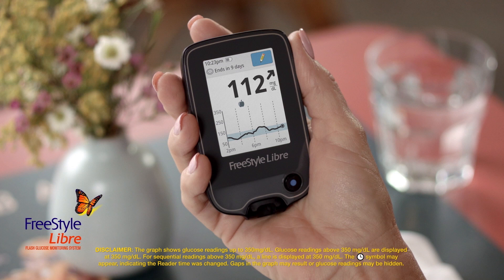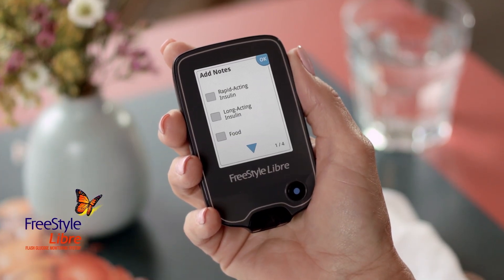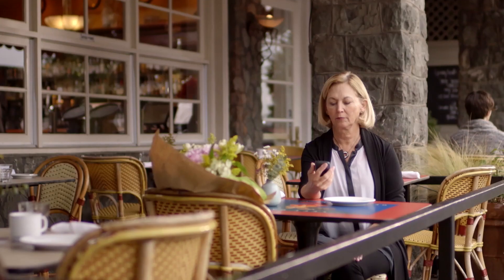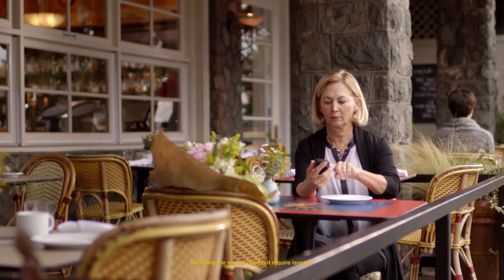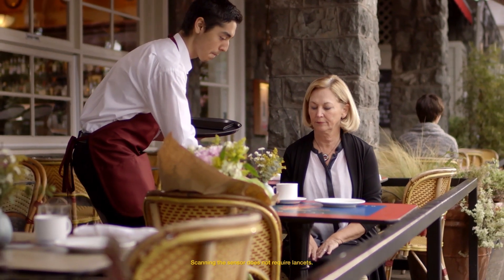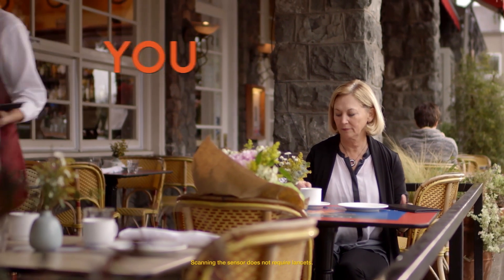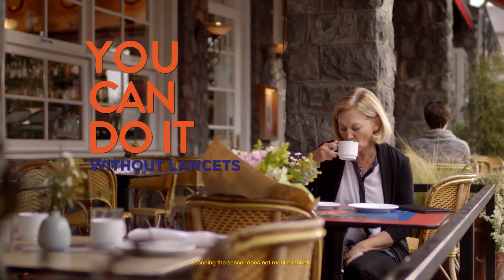The glucose graph will plot all your glucose readings and display the most current 8 hours of data. If Sarah taps the pencil icon, she can add notes about food, exercise, or an insulin dose. Instead of the interruptions of routine finger pricks and test strips, now Sarah simply scans to get her reading. Why prick when you can scan?